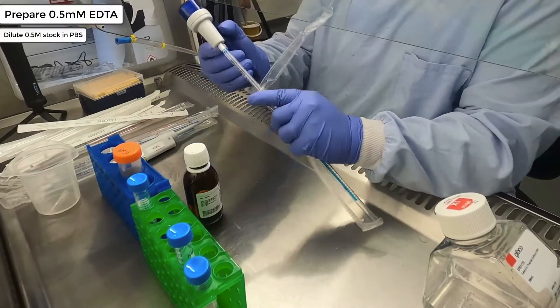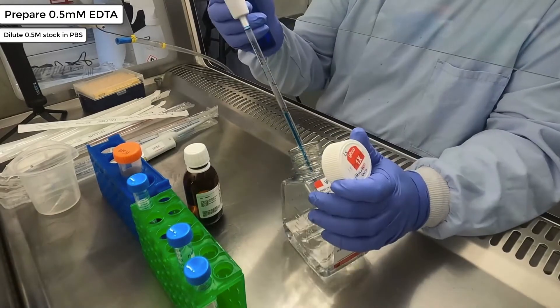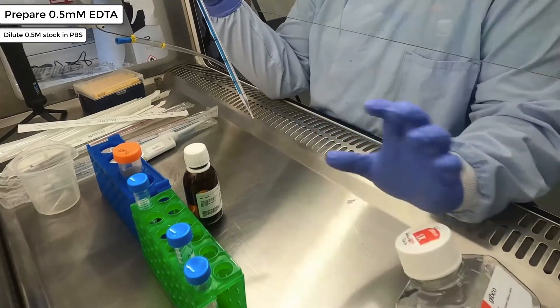The next thing you should do is prepare your 0.5mM EDTA. You do this by performing a 1 in 1000 dilution of your 0.5 molar EDTA stock in PBS.